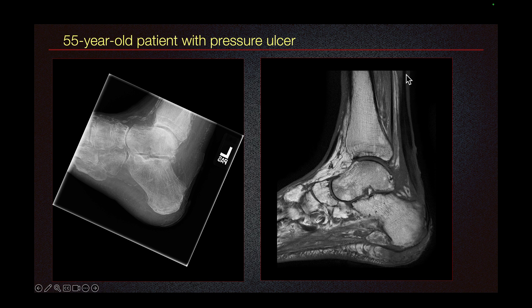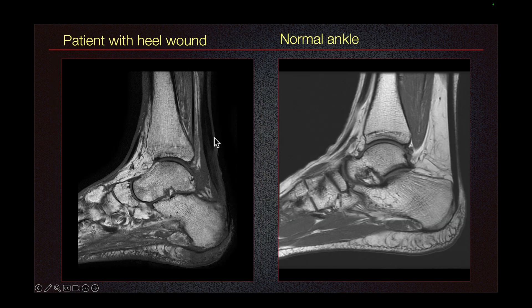This patient has an additional finding in the Achilles tendon. The Achilles tendon should appear nice and dark like this, but as we go below, it has increased signal. So this person also had tendonitis of the Achilles tendon as a result of the ulcer. Here we can compare the T1 hypointense marrow signal with normal T1 signal, and also compare our abnormal Achilles tendon with a normal Achilles tendon.